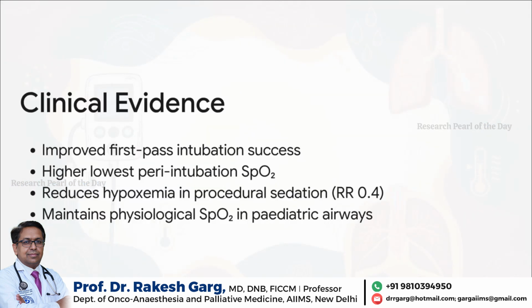Now you might be thinking, okay, cool theory, but does it work? Absolutely. The clinical impact is staggering. Major meta-analyses, like the extensive reviews done by Silva in 2017 and Fuchs in 2024, show this mechanism directly translates to patient safety. We are seeing significantly improved first-pass intubation success, we're seeing way higher oxygen saturation levels during the intubation process, and a massively reduced risk of life-threatening hypoxemia during things like procedural sedation. It even safely maintains oxygen saturation in complex pediatric airways.